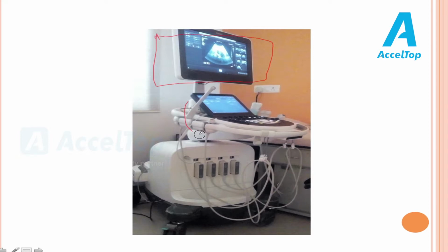You can see this is the working area with multiple knobs. These are the probes. Here one probe is there, and this is another probe. Here you can see another probe. These are all the probes, and these are the areas where the probe is connected. So what happens? These are the key components in the ultrasonography unit.